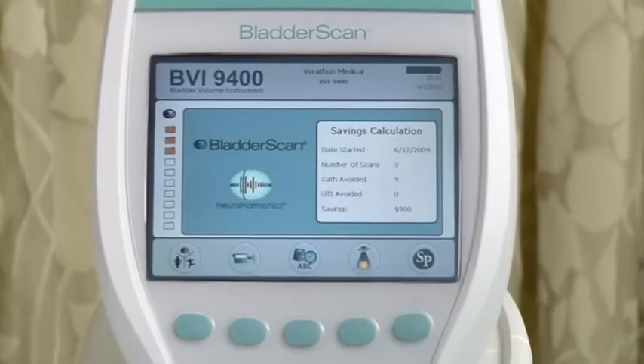It's also an important instrument to have in primary care practices, so the physician can determine the amount of urine in the bladder in patients who are at risk for urinary retention. In both these settings, the Bladder Scan tells the staff the amount of urine in the bladder without instrumentation and complications that can occur from catheterization. The Bladder Scan BVI9400 is a battery-operated portable instrument that has a color display console.